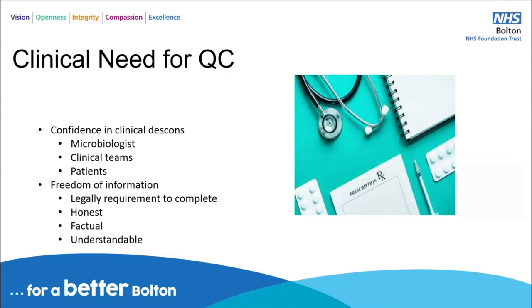So yes, from my introduction, I completely accept and understand and have felt the exact same feelings about control material and controlling processes, procedures and tests in the laboratory. And moving into a more clinical side of microbiology, I often reflect: do we need as many controls in the laboratory as we have been asked to do? Do we need controls in a clinical team? And actually, we do. For microbiologists, we need it for clinical teams, and we actually need it for the patient.